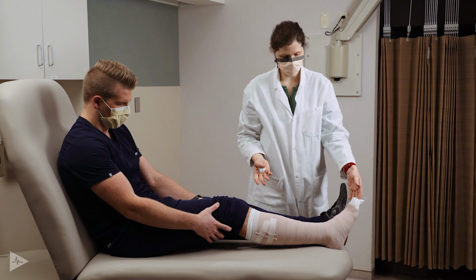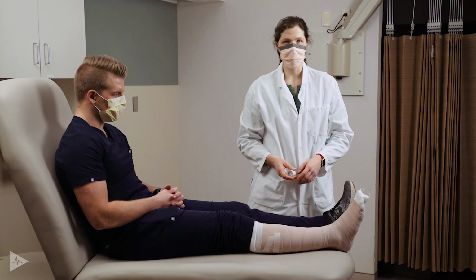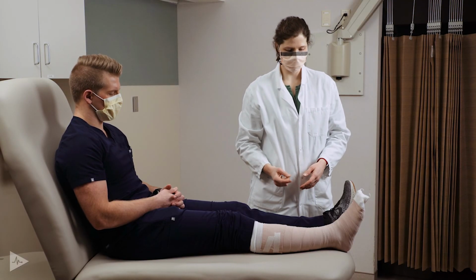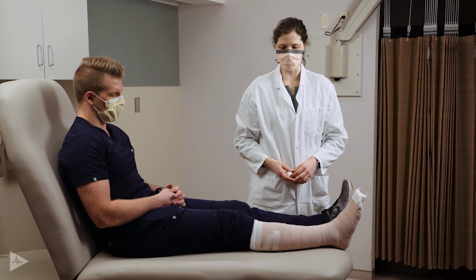And as you can see here again, we have that uniform figure of 8 running down the leg for the compression. The ACE wrap can also be applied in the spiral form, going up the leg. And again, that will just be a continuous one-way wrap coming up the leg without that crisscross pattern present.